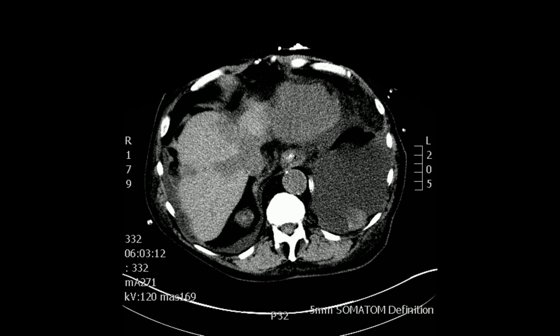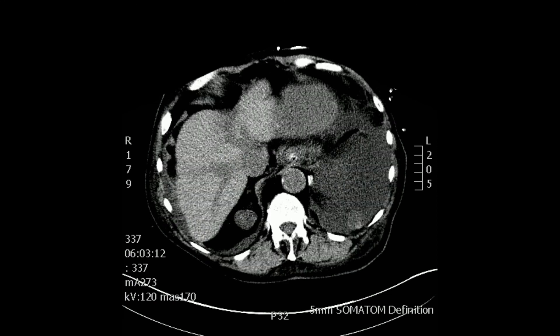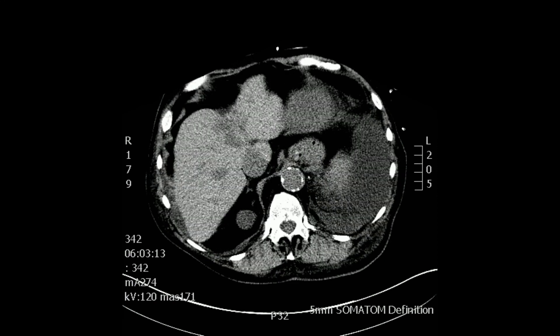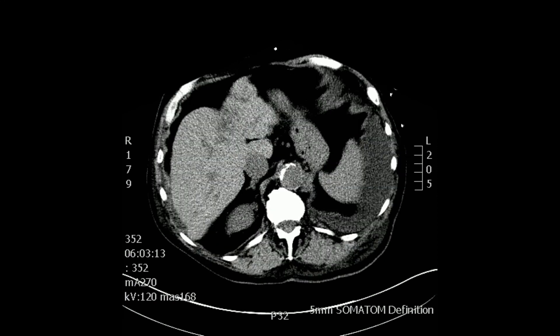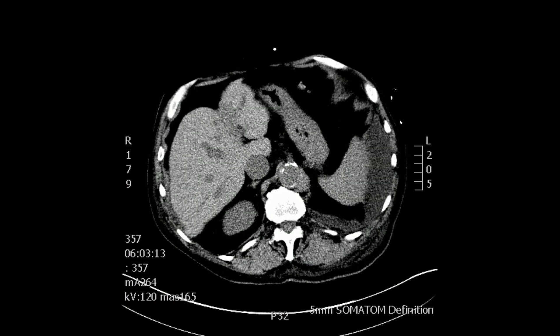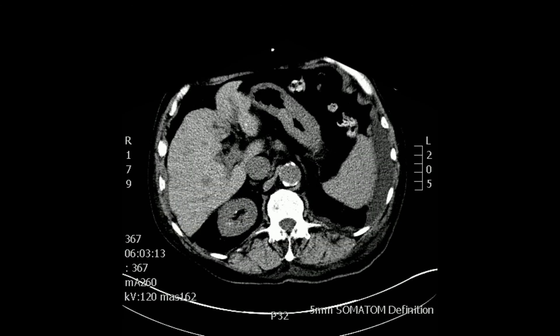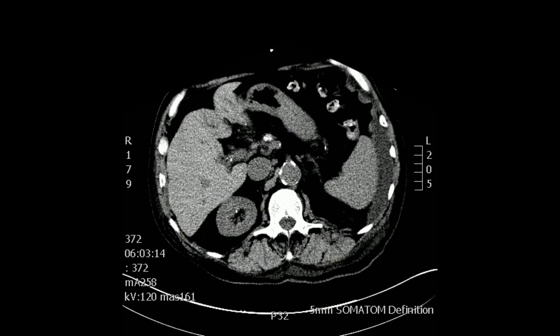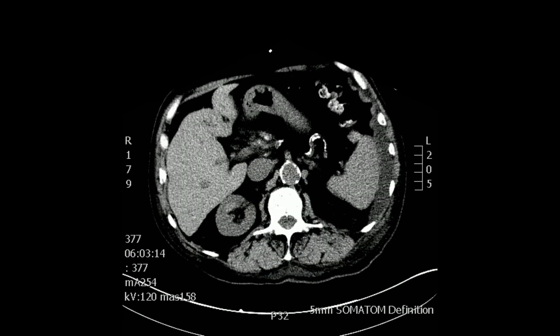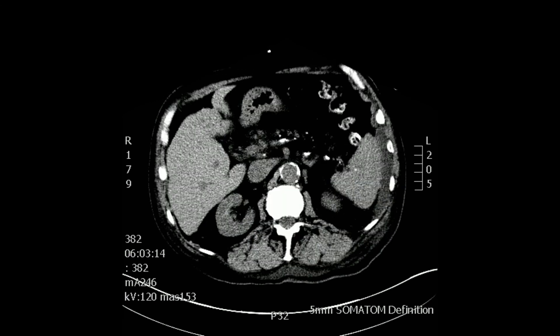Continuing to move distally, notice the heavily calcified abdominal aorta. You can see the liver and the spleen on the left side, and the very distal portions of the left pleural effusion in green. The abdominal aorta in red and the inferior vena cava in blue.